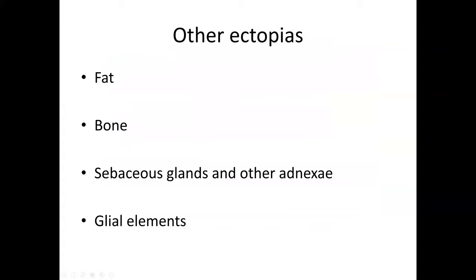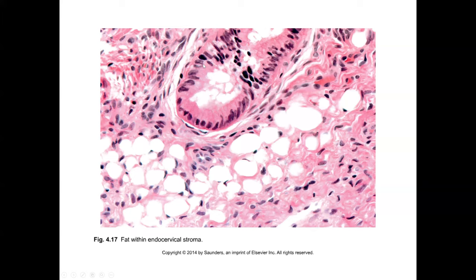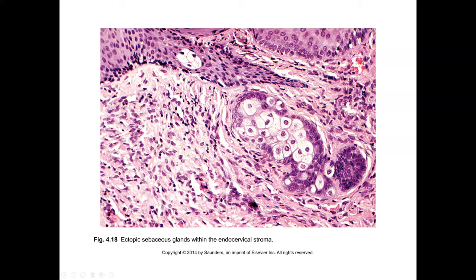There are a few other ectopias that can occur in the cervix: bone, fat, sebaceous glands, and so forth. Here's an endocervical gland with surrounding stromal microcystic lipocytes representing ectopic fat. Another finding that can occasionally be seen is sebaceous ectopia — sort of a dermoid cyst type of thing without the cystic component — and that's again a completely benign finding.